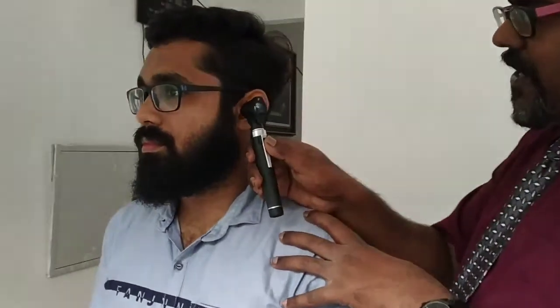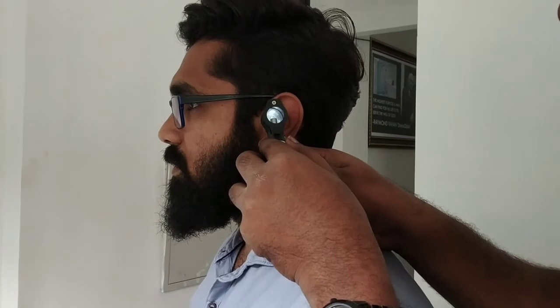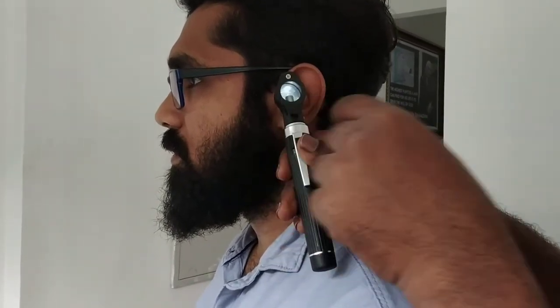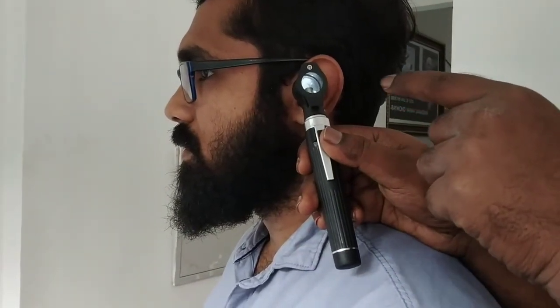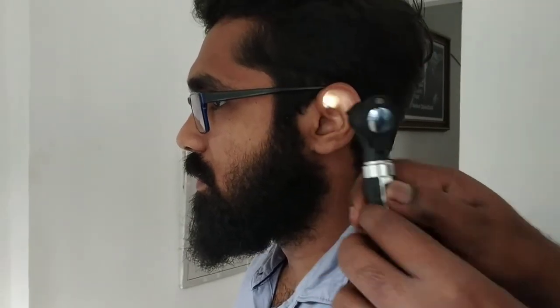So most importantly, you just look over this. See, you can use this like this, and you can clearly see through the naked eye also. We can see the eardrum of the patient clearly. Okay, so this is the way we can use this. Very simple equipment, very simple and moderate equipment.